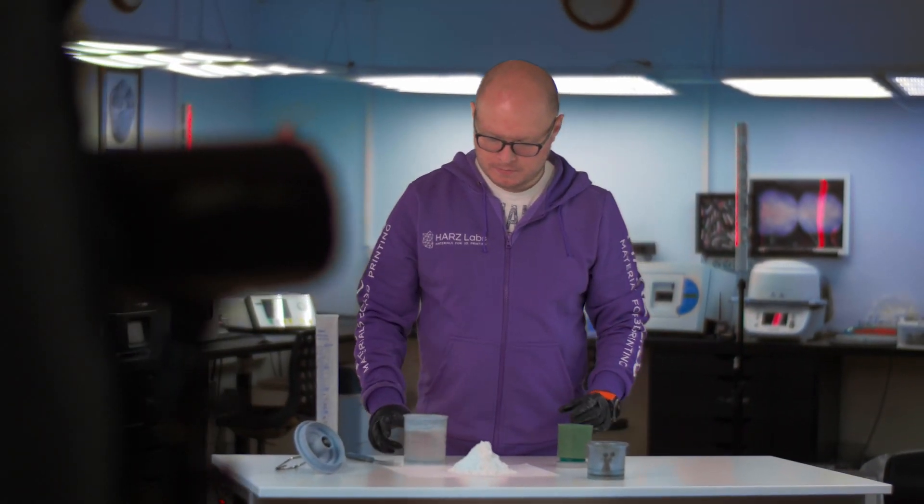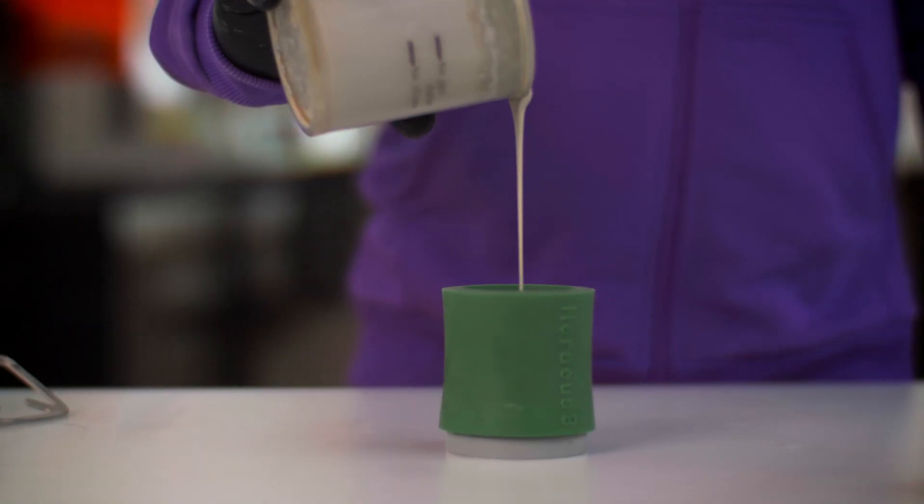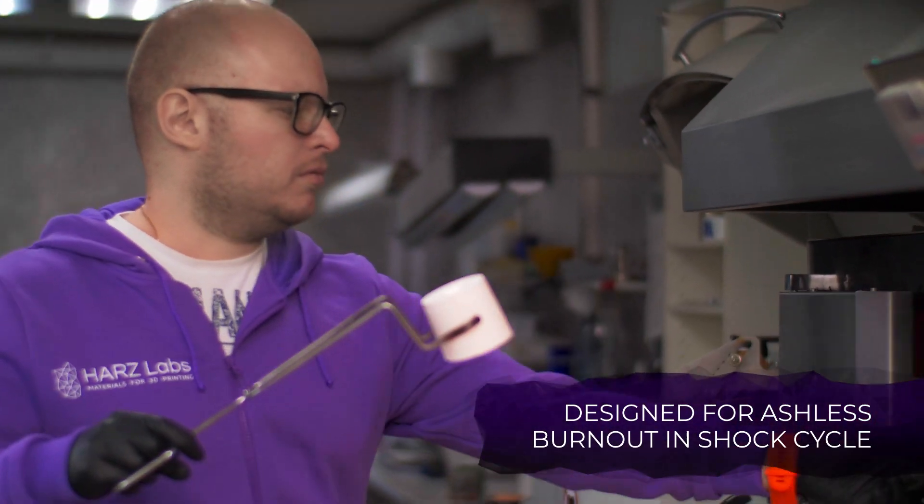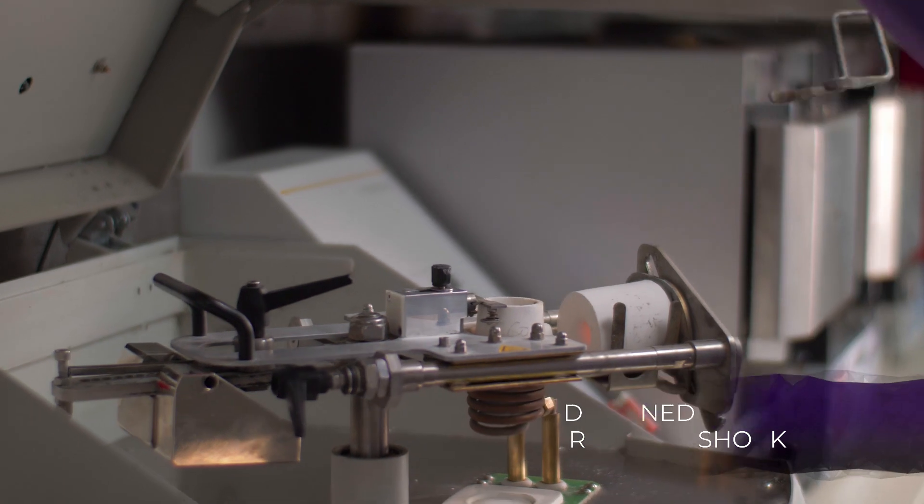After printing, the technician prepares the mold, using the investment and resin for a shock cycle. This allows achieving an ashless resin burnout and reduce the time required for casting metal implants or pressing ceramics.